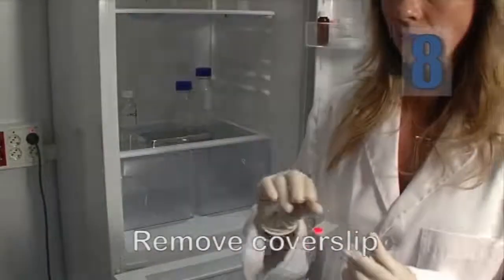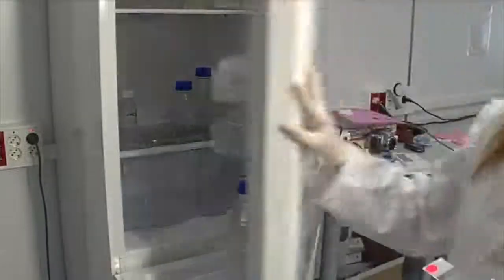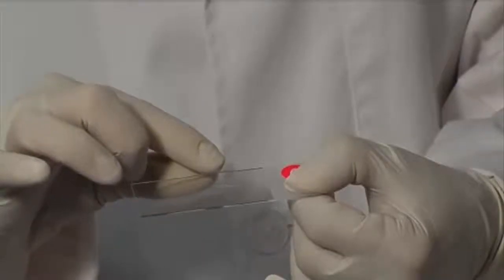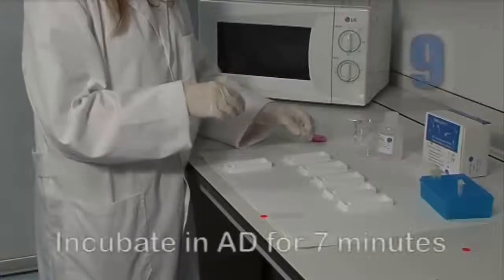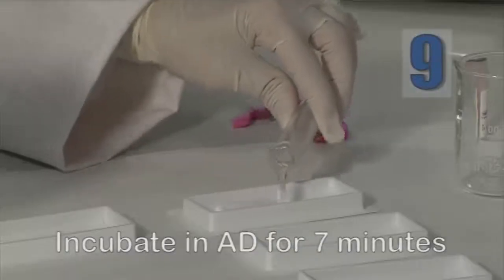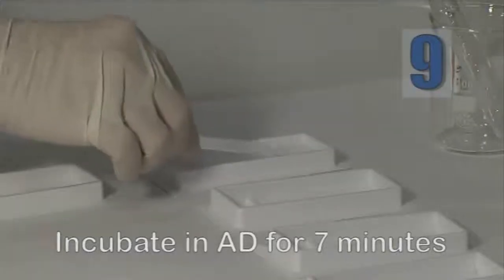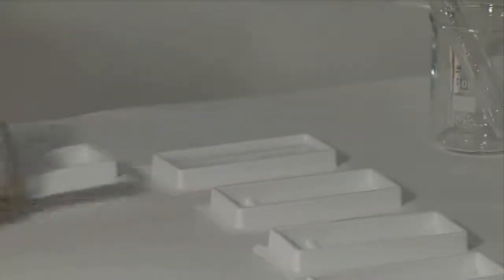Take the slide out of the refrigerator and remove the coverslip by sliding it off gently with your finger. Be careful not to lift it up directly. Incubate the slide in the denaturing solution for 7 minutes at room temperature, always maintaining the slide in a horizontal position.